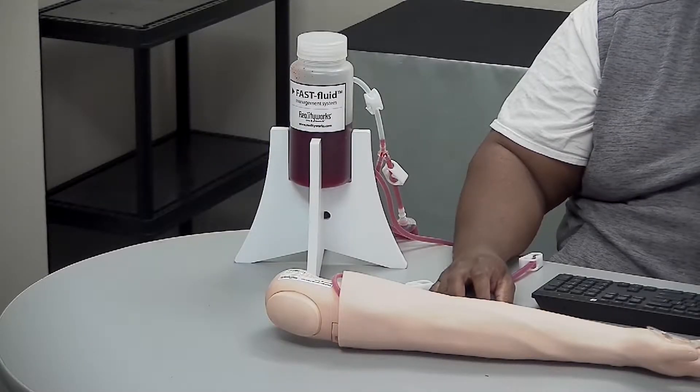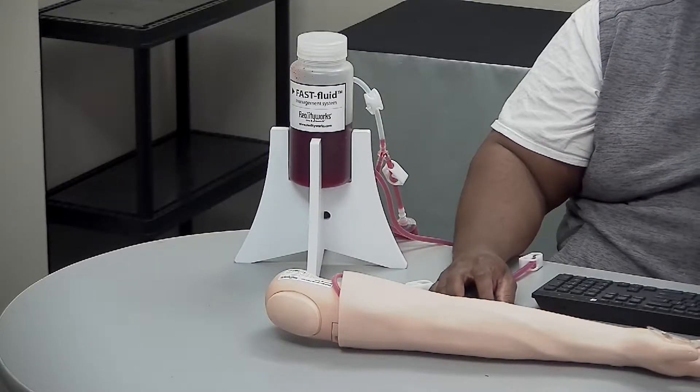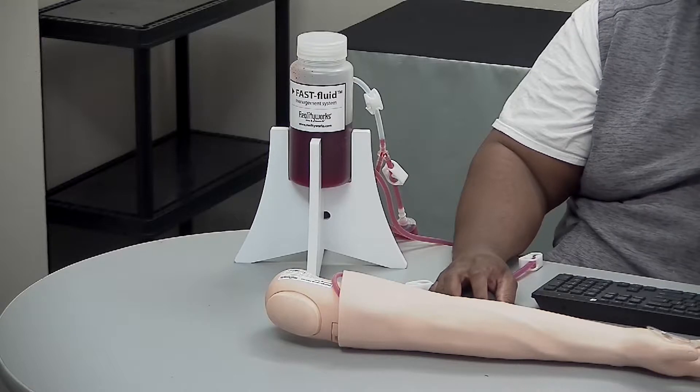Hello, this is a quick tutorial on performing an IV insertion using the RealityWorks multi-purpose venous training arm.